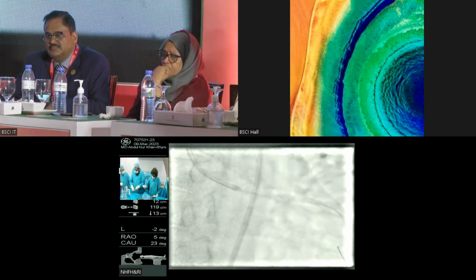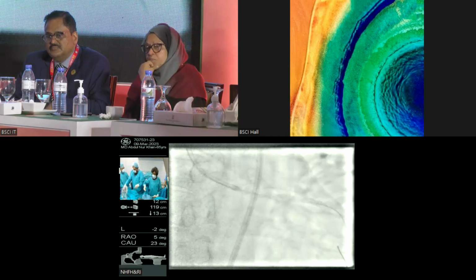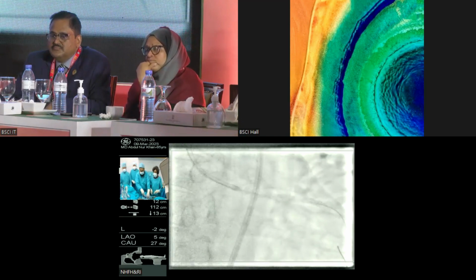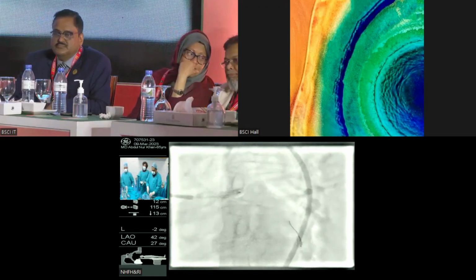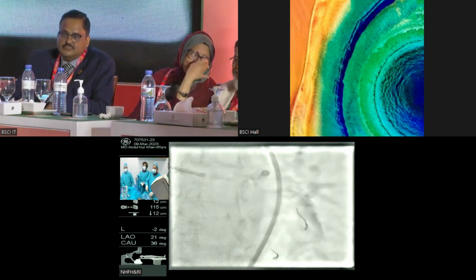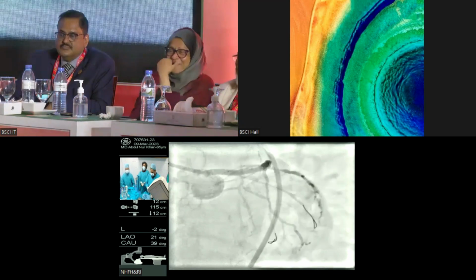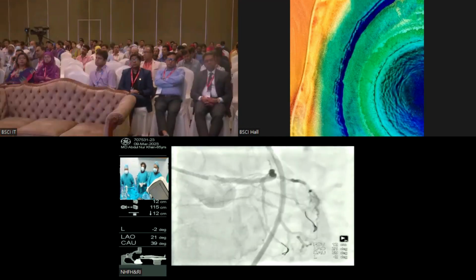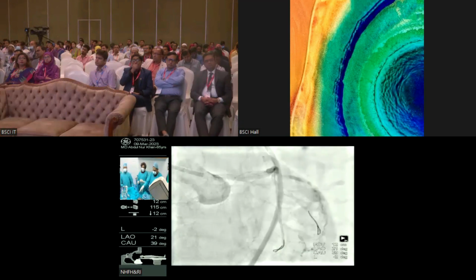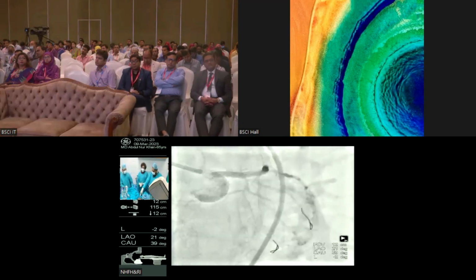But yes, IVL is another tool that helps us tackle calcium, because nowadays, as we treat more elderly patients, more patients with chronic kidney disease and diabetes, we are seeing a lot of calcium. These patients have very complex anatomy and warrant different strategies to tackle their calcium. And indeed, IVL is such a tool. But I personally find the rotor very versatile, because if it's a balloon uncrossable lesion, you can't take IVL initially. Maybe later on you can. With a rotor, if you can pass the rotor wire, you can create a passage through which you can subsequently take your other tools.